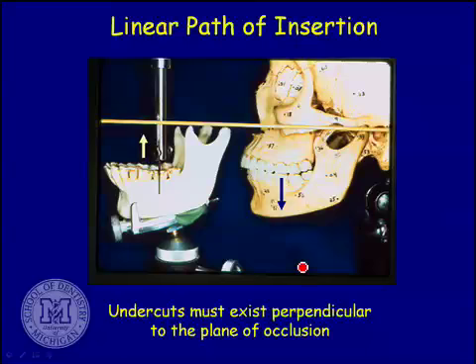But supposedly if I dinked enough, well, really what should have been happening is you just orient the cast so that the occlusal plane is level front to back and level side to side. Draw a design that would be my most ideal framework design that I'd like to draw. Forget the contours of the teeth, just draw a nice design. Now go back and look at the teeth, now that you've got your design drawn, and say, which areas of the teeth are going to work with the design I've drawn, and which contours on the teeth, typically axial contours, are fighting me, are not working with the design I've drawn.